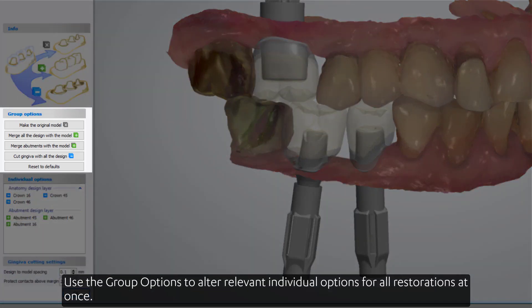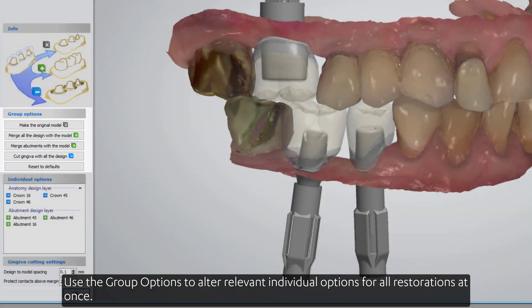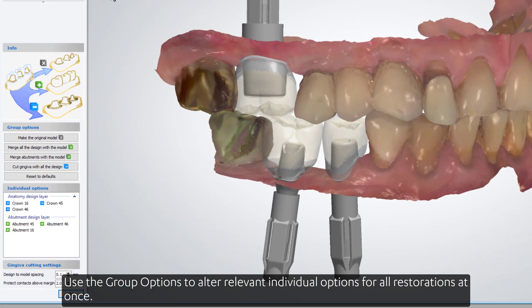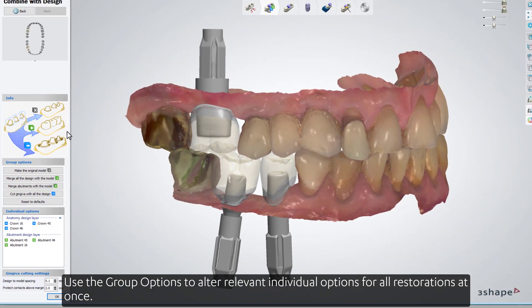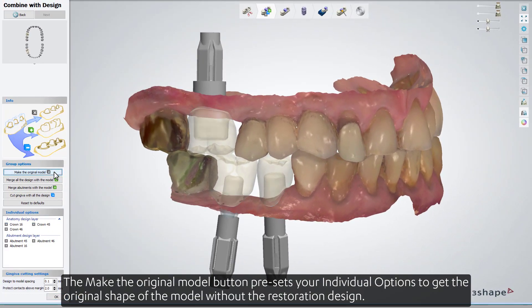Use the group options to alter relevant individual options for all restorations at once. The 'Make the Original Model' button presets your individual options to get the original shape of the model without the restoration design.